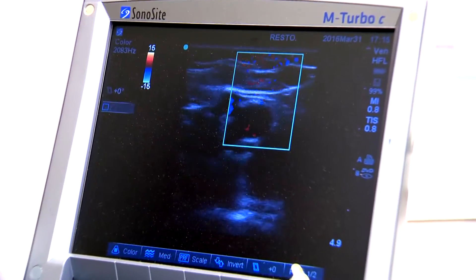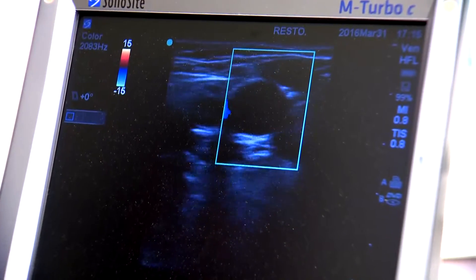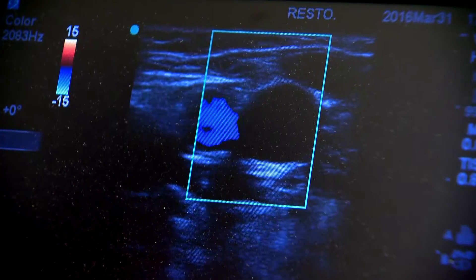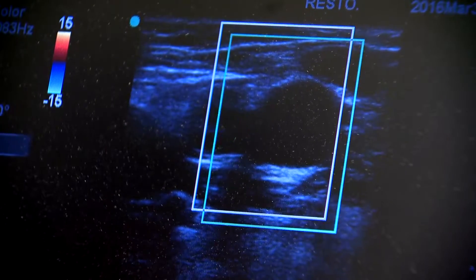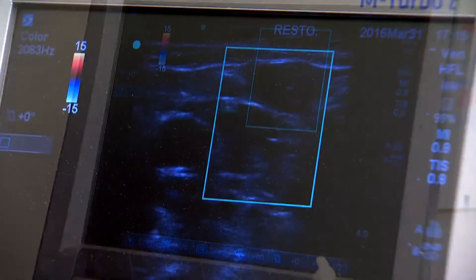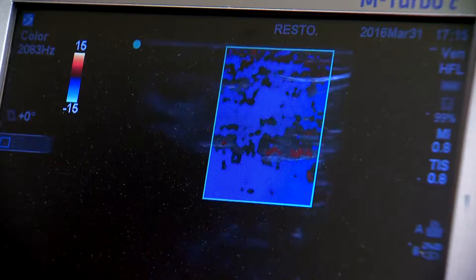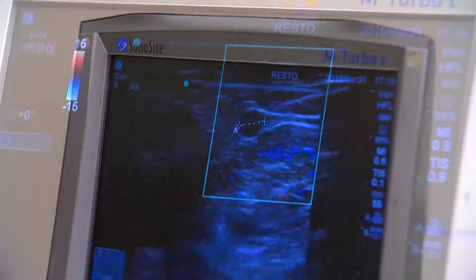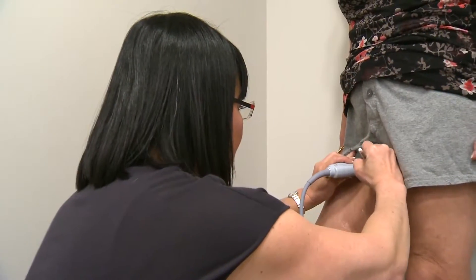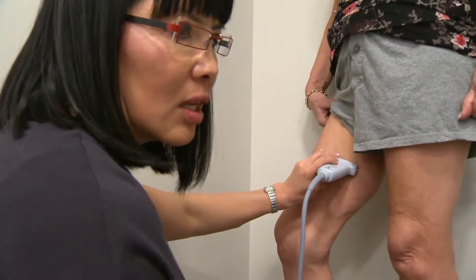We start the assessment at the top of the leg and look for the Mickey Mouse sign. One ear is the femoral artery, which is seen to be pulsating. The face is the deep femoral vein and the other ear is the more superficial greater saphenous vein. When the patient coughs, blood is seen moving from the deep vein to the more superficial vein. This means the valve that normally prevents this direction of flow is not working, resulting in the production of varicose veins lower down in that leg.